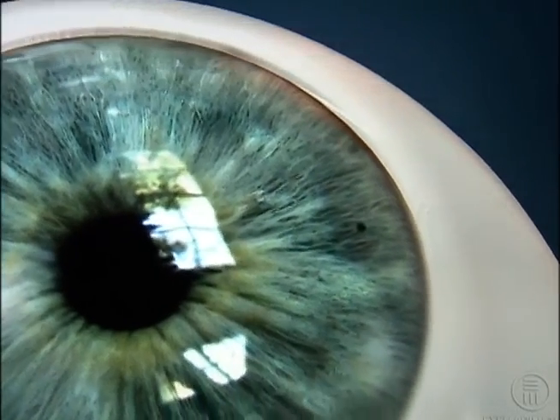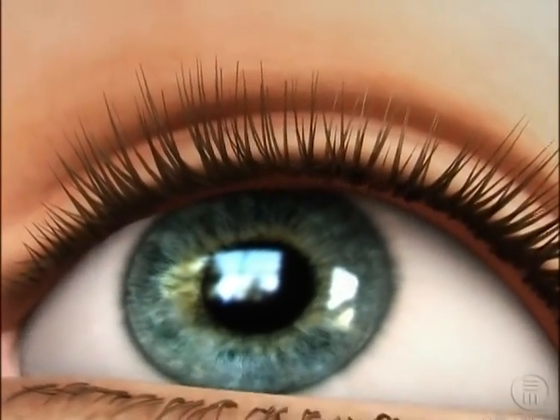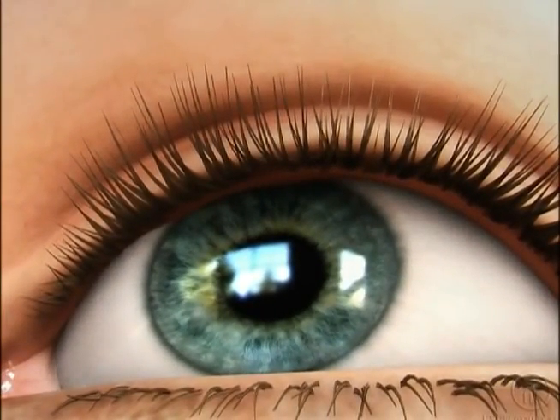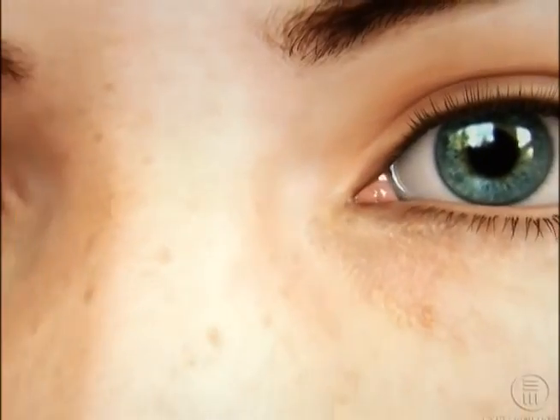The hole will not affect your vision and in most cases is positioned under your upper eyelid so that no one will be able to see it. Soon after the procedure is completed, you may return to your normal activities.